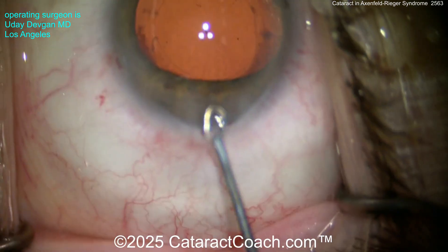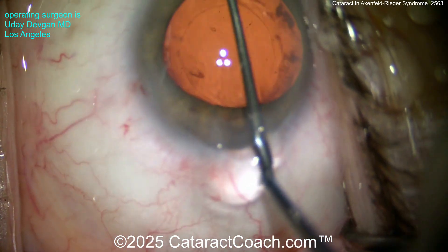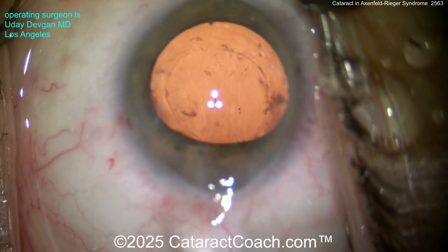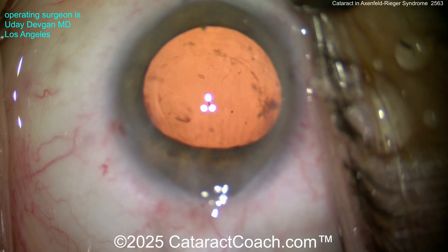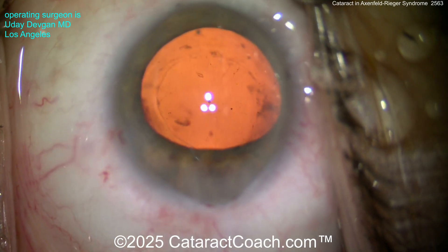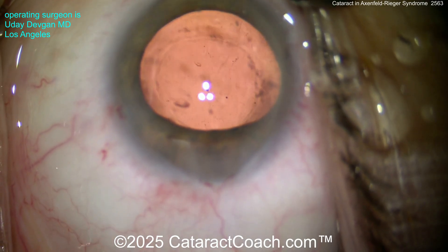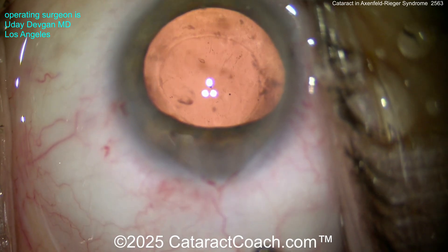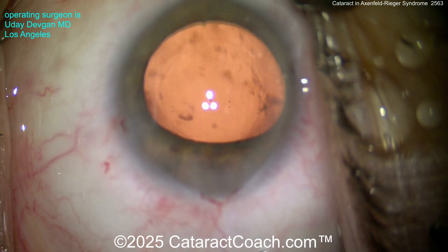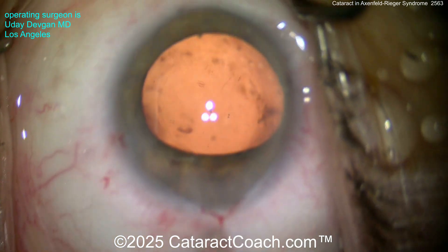What happened to my capsule polisher? Someone was messing with it — that happens sometimes. It'll still work; we'll get that straightened out and fixed. But look — we'll polish up that capsule. It looks clean and beautiful. The rhexis is centered up where we want it on the patient's actual true anatomy. Don't use the dilation as your guide. I want to show you the video unedited, start to finish.